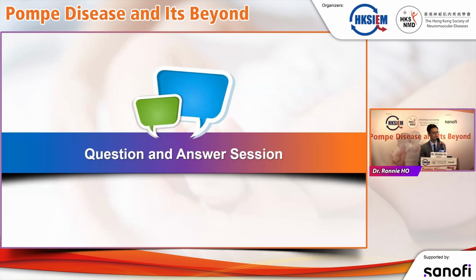I think lipofuscin itself is not specific for Pompe disease because, as mentioned, it is an aging pigment. It can be observed normally in the heart muscle, in liver, even in the GI tract, etc. So it's a phenomenon that you observe in Pompe disease that will aid your diagnosis because it reflects the underlying mechanism: the defective autophagy leads to mitochondrial abnormality and hence the creation of lots of oxidative species in the muscle. So it's a sign of oxidative damage to the muscle fibers.